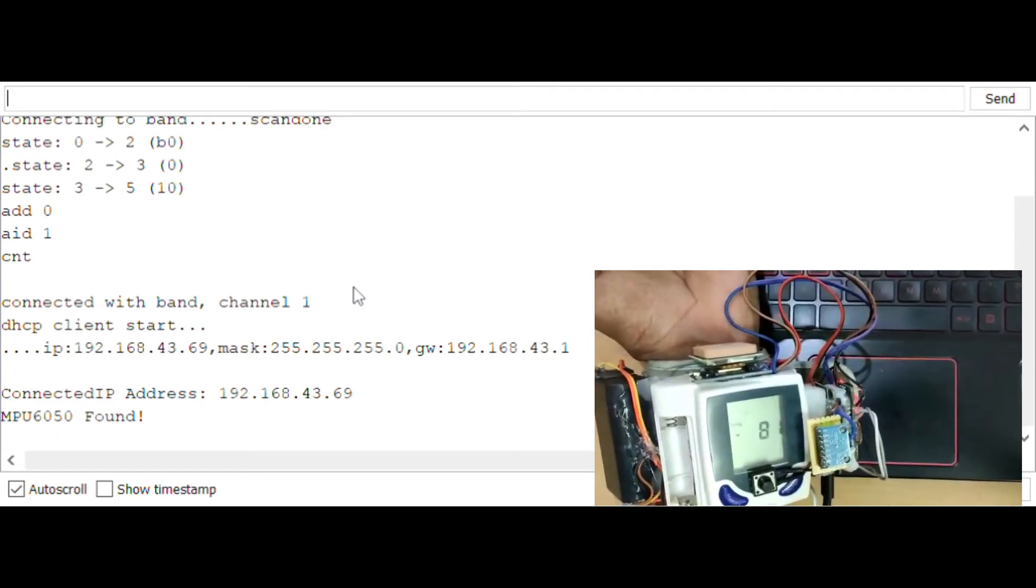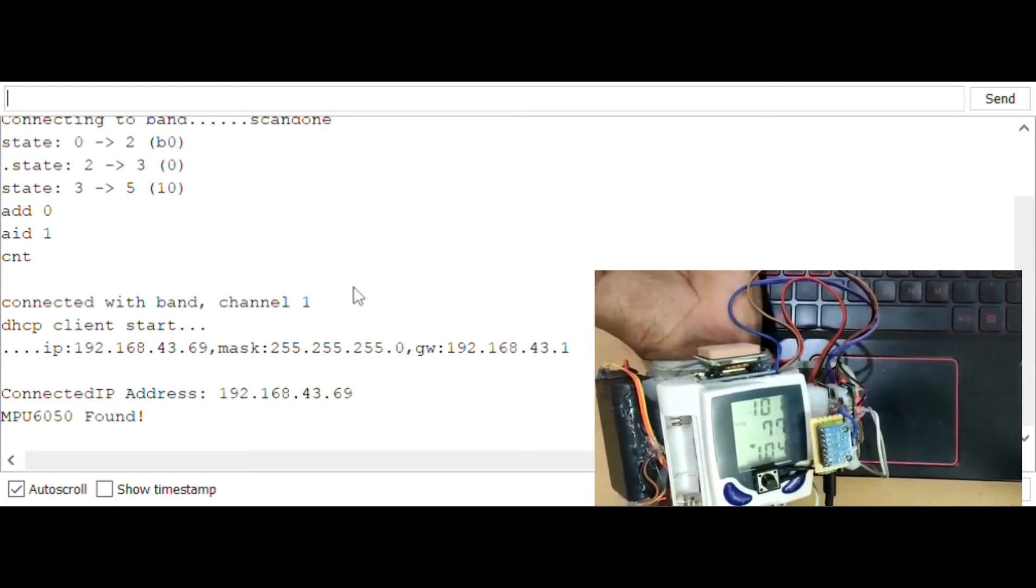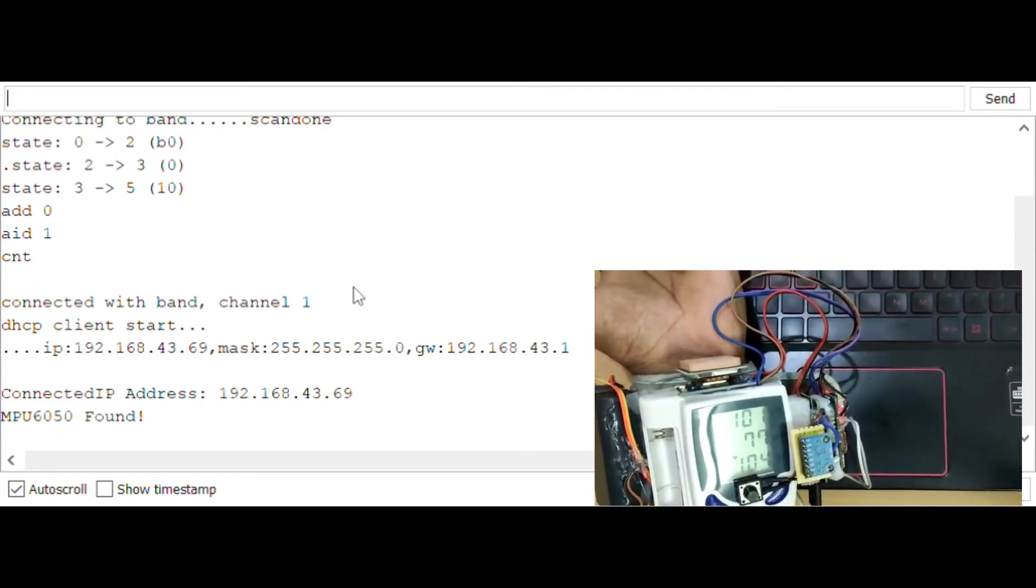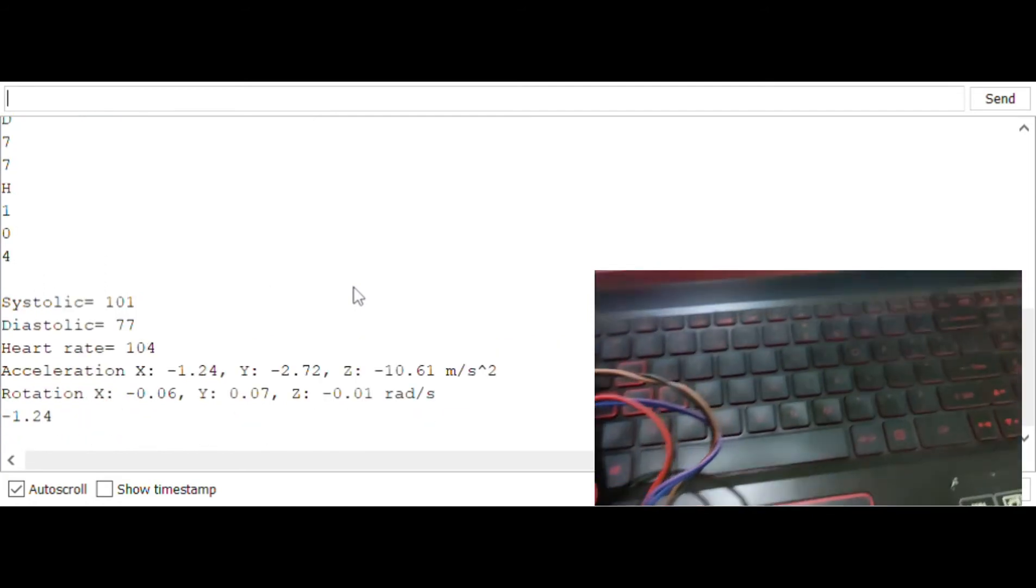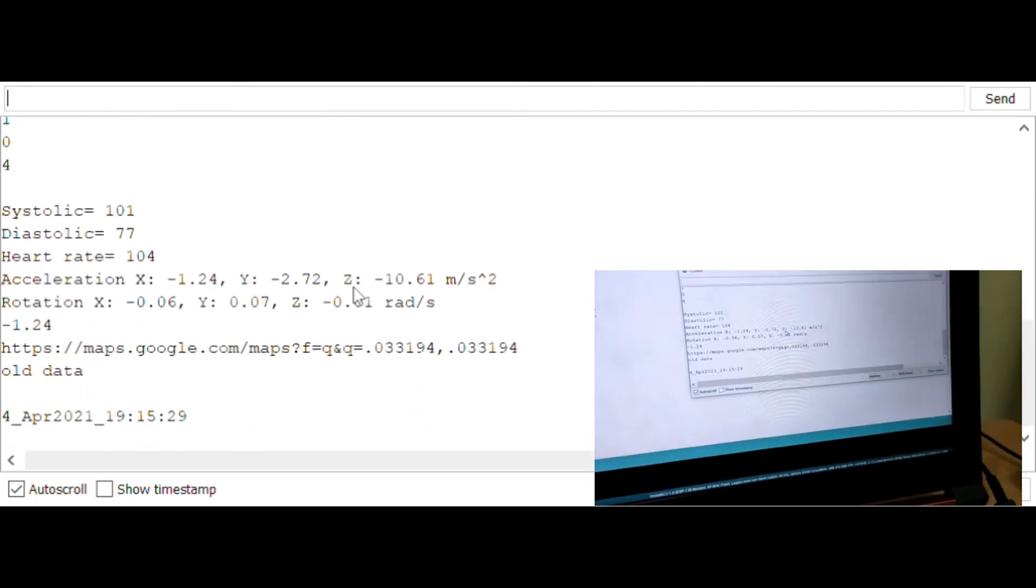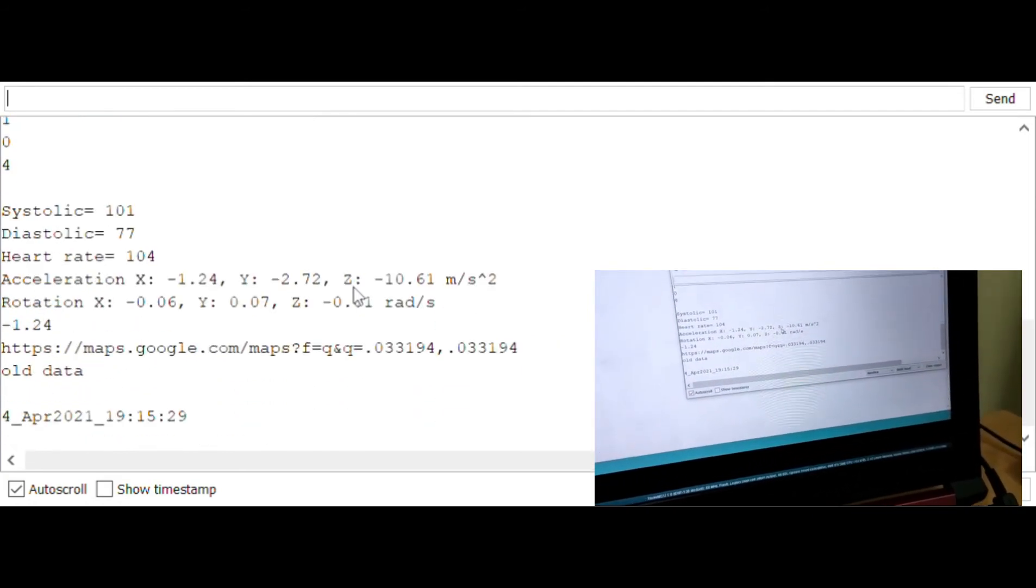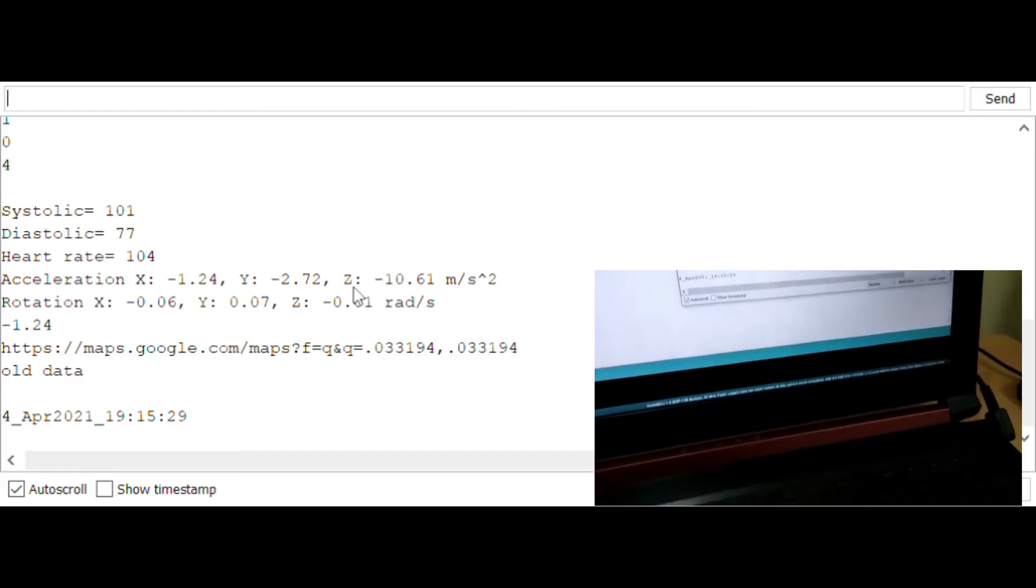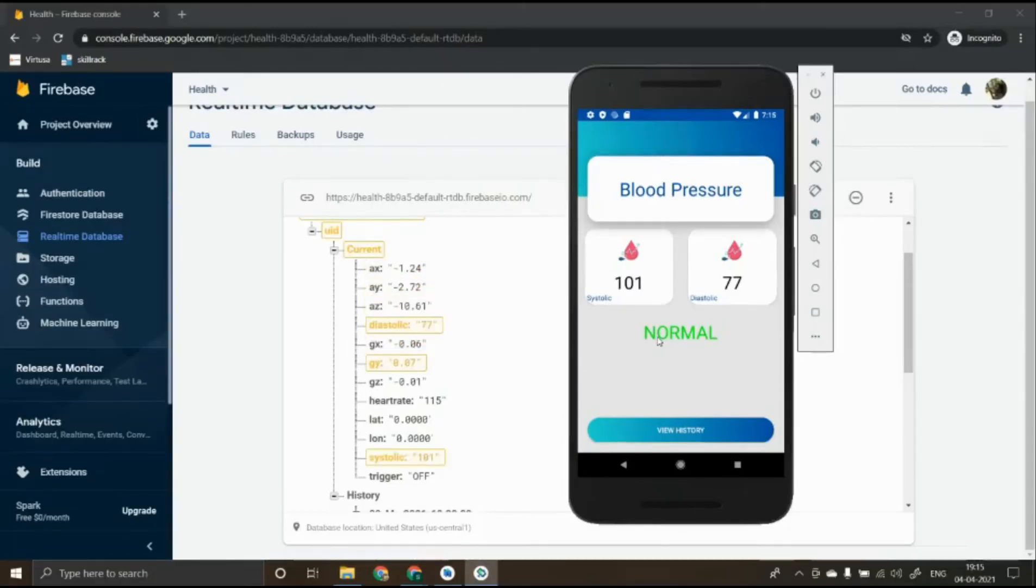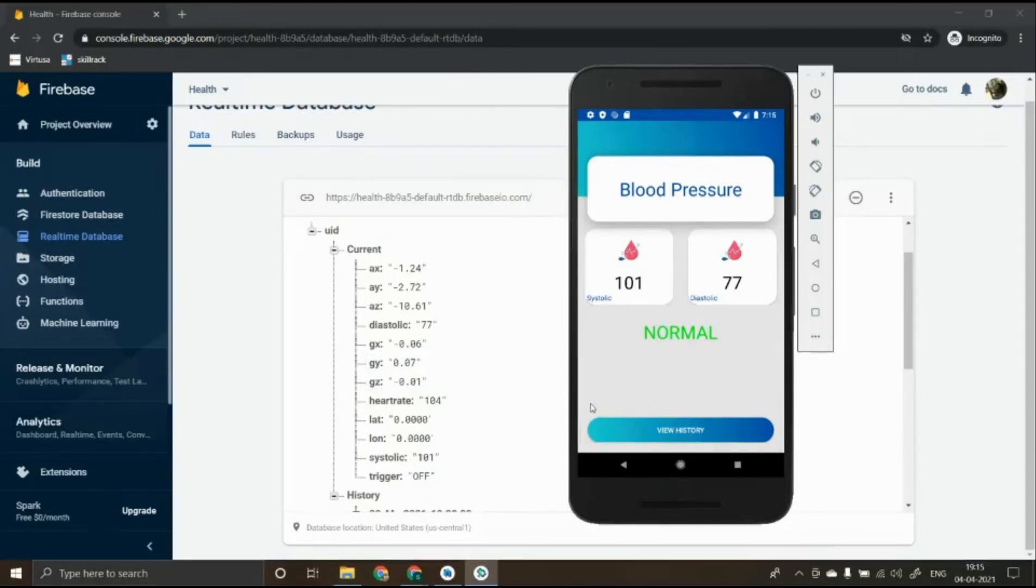As you can see the readings are recorded and are printed in the serial code. These data are now uploaded to the Firebase database. Here we can see the values getting updated. And the values in the mobile application are updated instantaneously. This not only stores the current live data, it also keeps track of the history which is shown below.